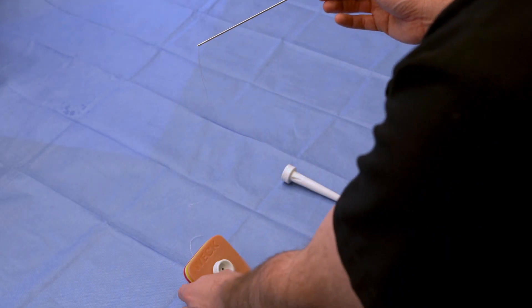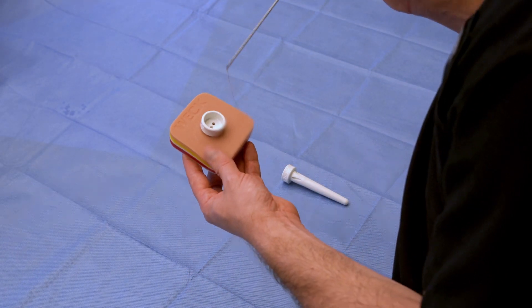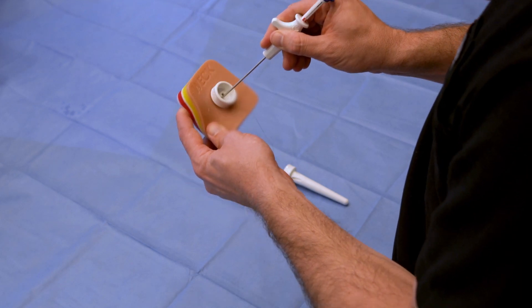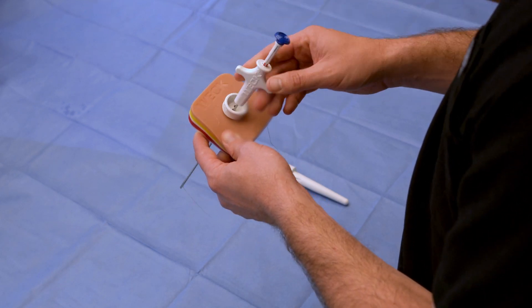Under direct visualization, insert passer tip through the soft tissue. Don't press the button to maintain the grasp on the suture.